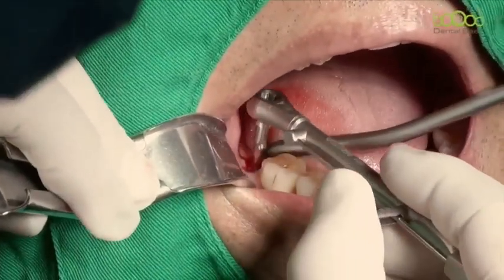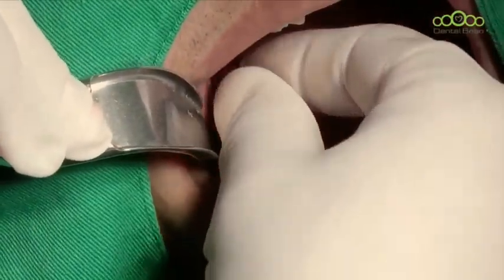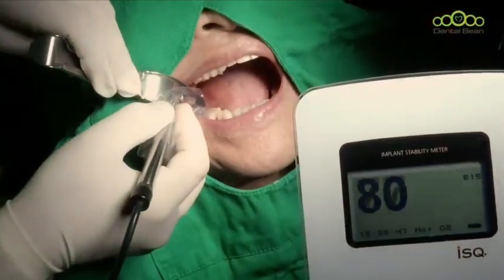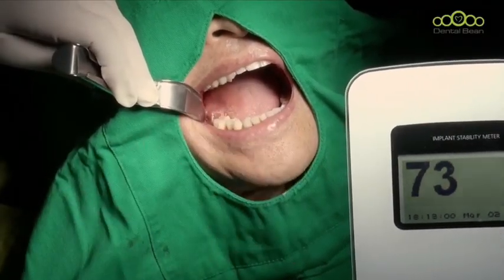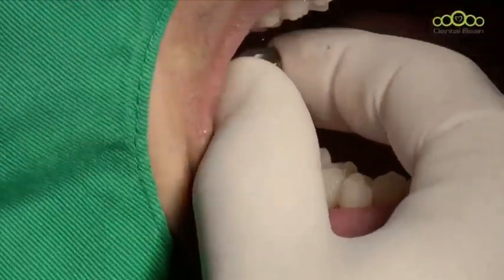It is laser marking on that implant driver. The last marking is 5 millimeter. So I checked the ISQ value, look at the enough ISQ value. I can finish the surgery, connecting the healing abutment.